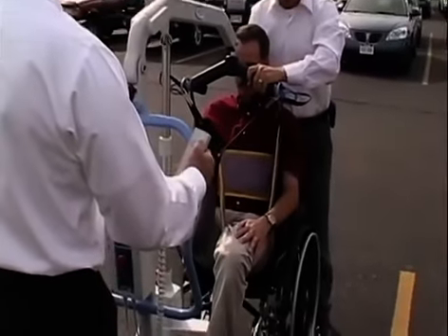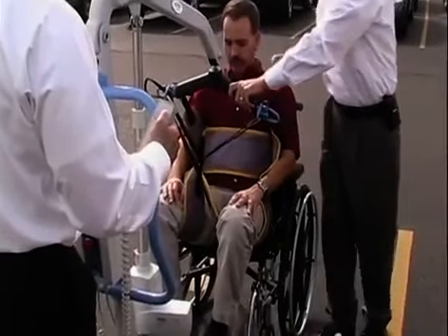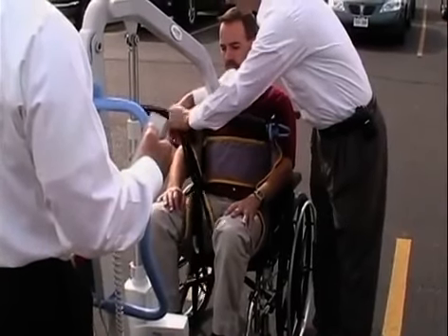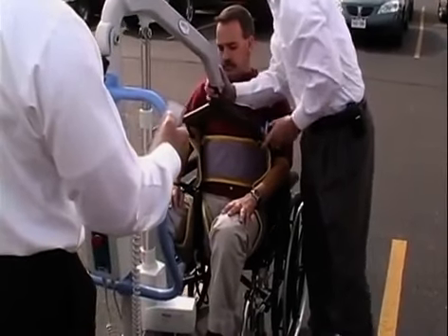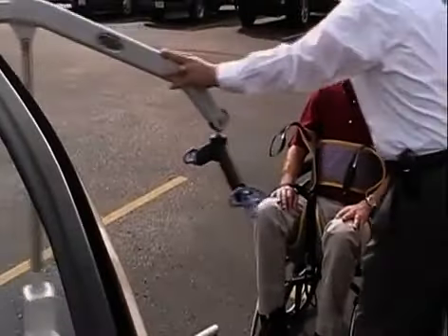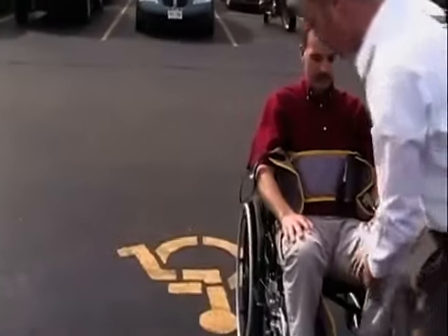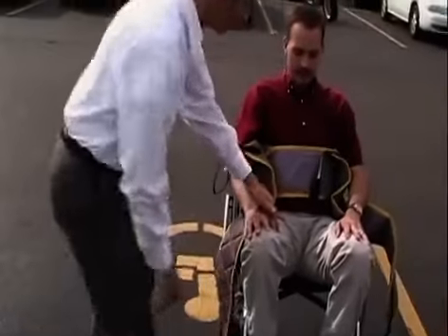I'm going to make sure that the back's in place. As we're doing that, we're going to back up the lifter just a little bit to give you a little bit more distance. Now, I'm going to start taking these leg straps off — the first one, the second one, the third one, the last one. I'm going to uncross the leg straps, and I'm actually going to tuck the legs down and away, draw one side, and then do the same with this side, drawing both sides out.